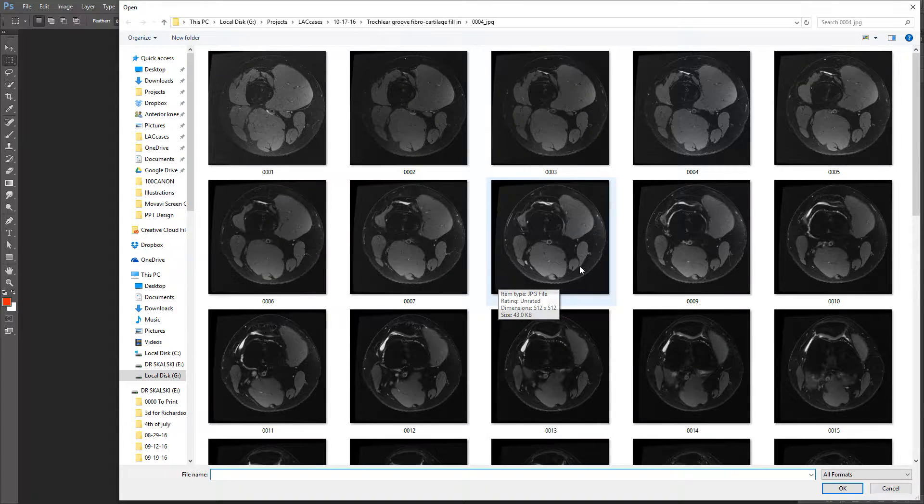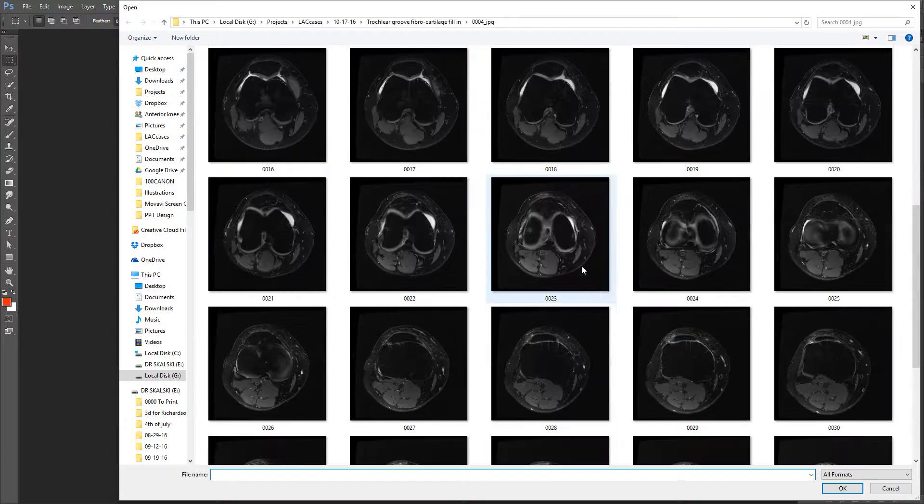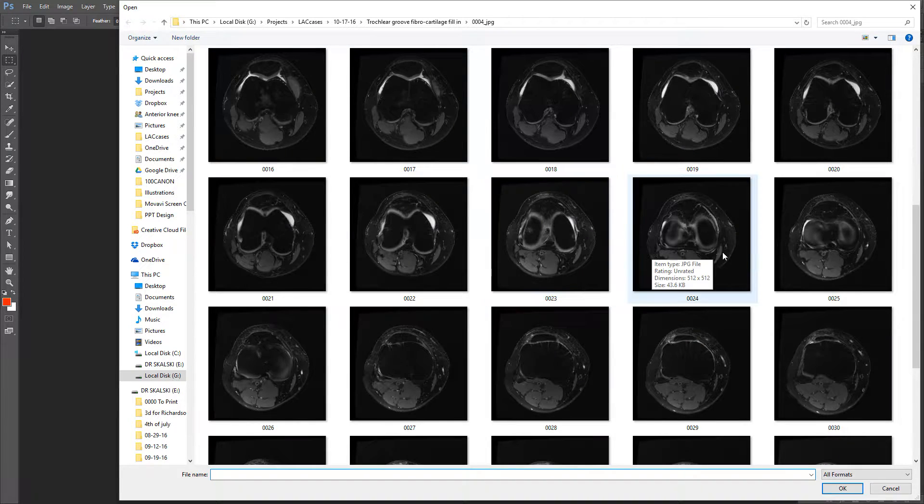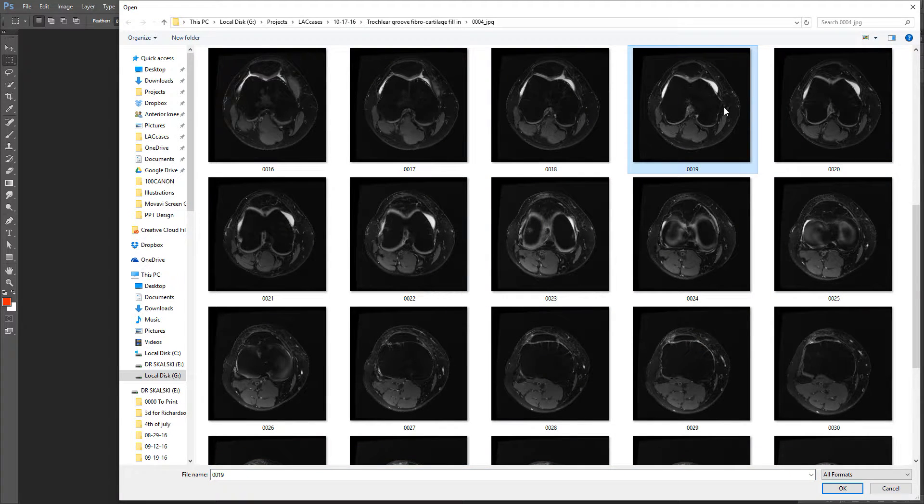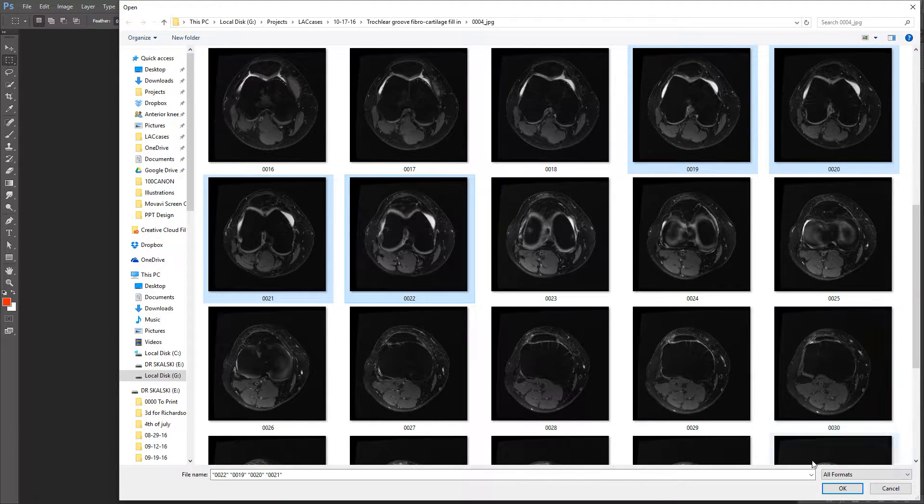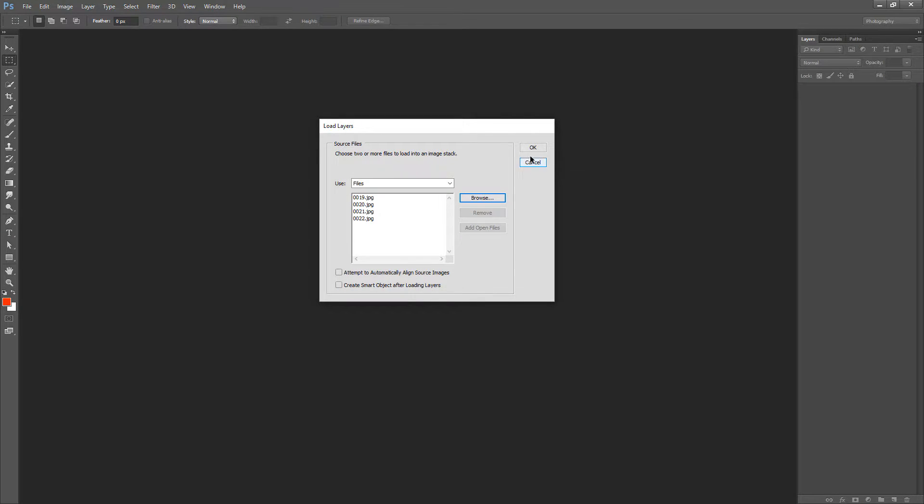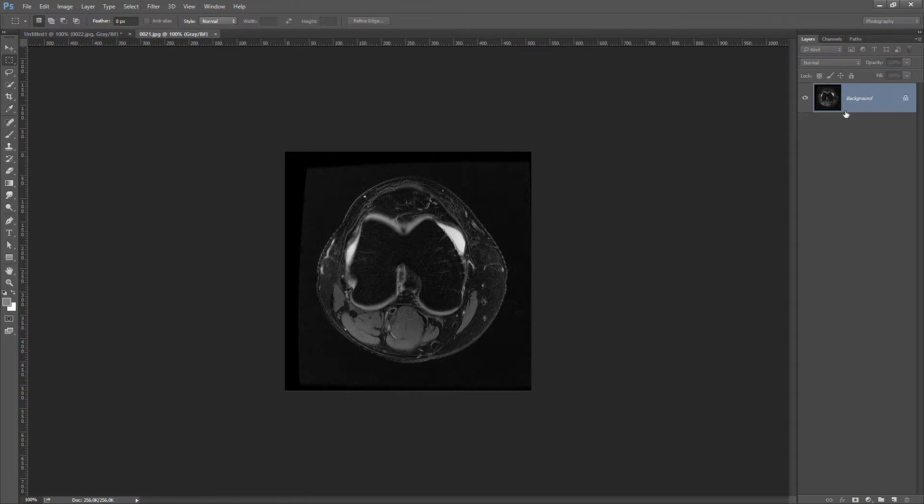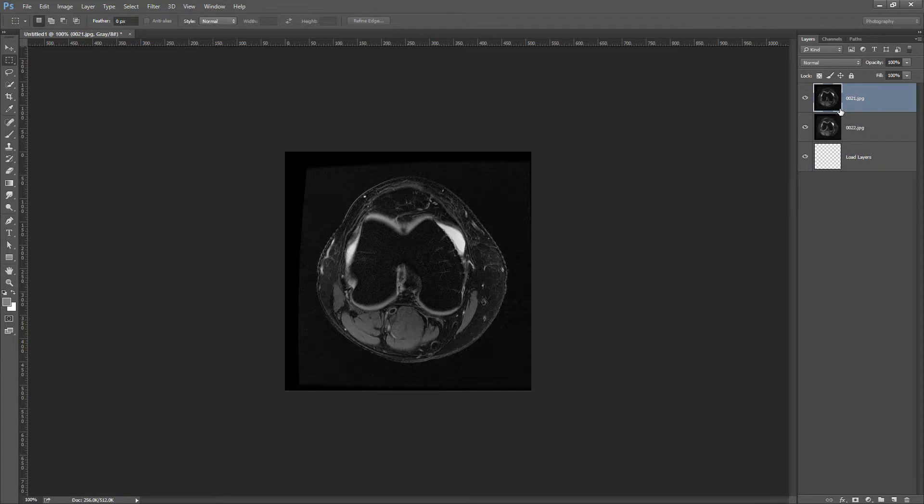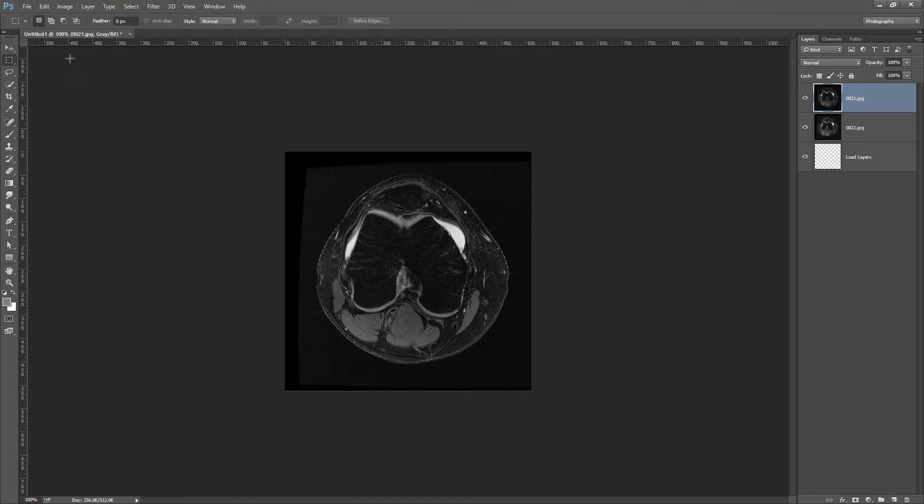I'm just going to show some fibrocartilage fill-in in the trochlear groove. So I'm going to grab one slice above it and then one slice below it, just a couple slices here. Then I'm going to click OK and it'll populate those into my Layers palette over here on the right.